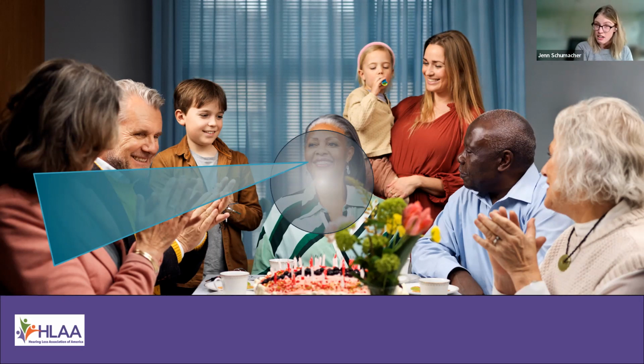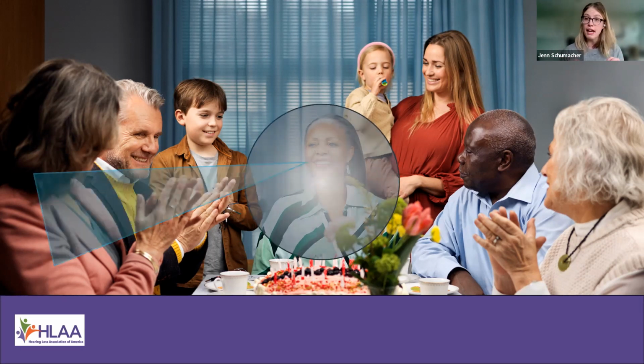So with this type of strategy, where we have these very directional microphones, you can actually lose out on a lot of sound going on around, which can cause you to lose out on what you may want to hear. So at ReSound, we actually do a hybrid approach. We have one ear in that directional mode. So one hearing aid keeps in directional mode, so that you can focus in on someone to your front. But it also keeps the other hearing aid on the other ear in more of an all around mode, so that you still have some awareness of what's going on around you.